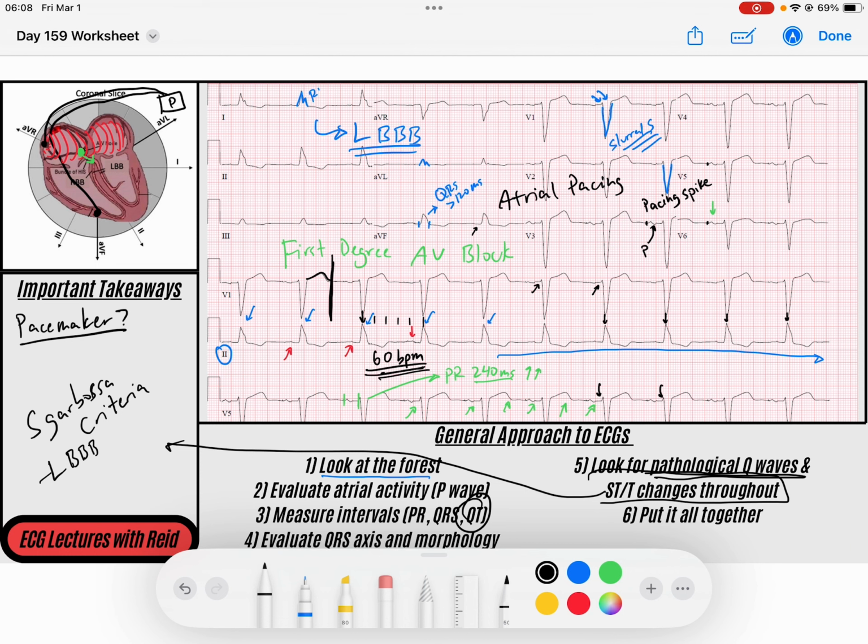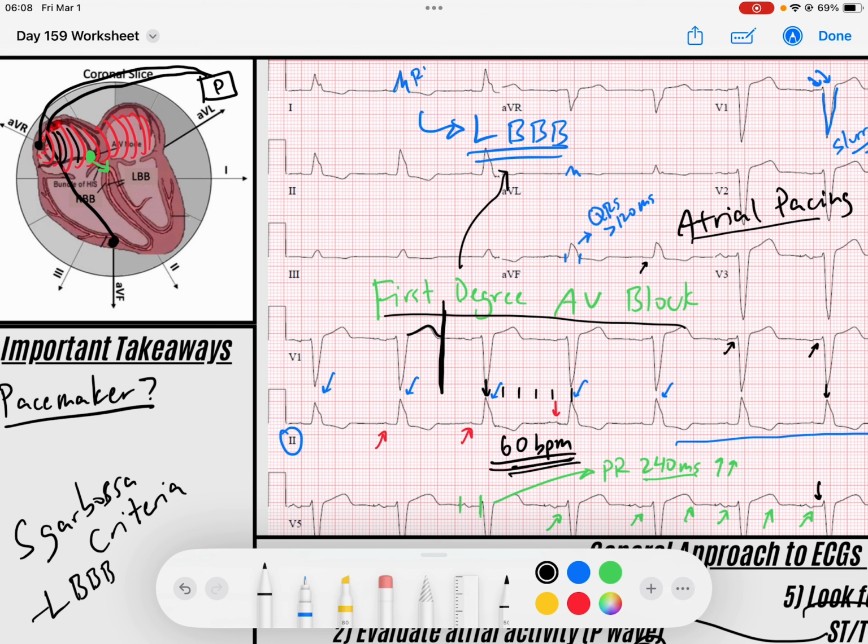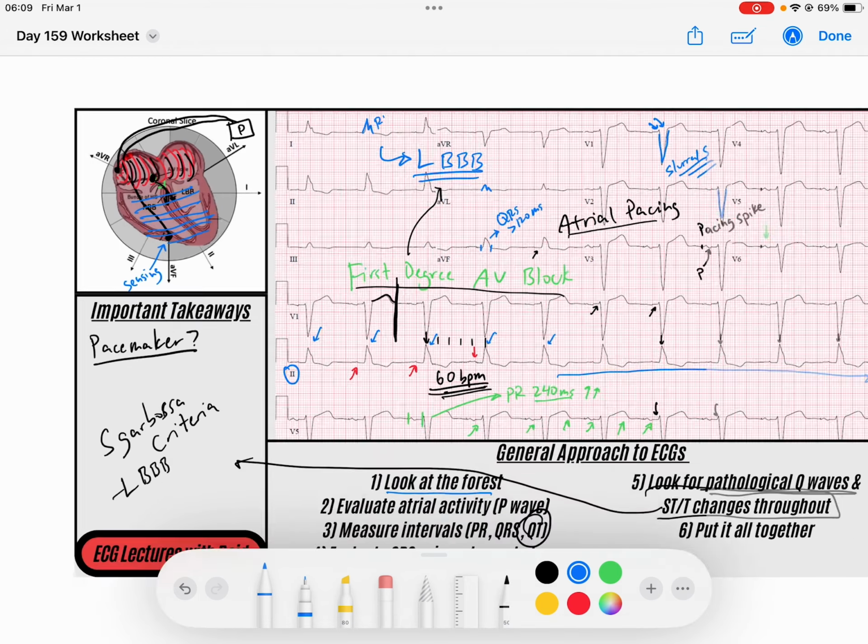And so what do we have? We've got a rhythm that has atrial pacing with a first degree AV block and a left bundle branch block. And so we know that nowadays the standard of care is a dual chamber pacemaker. And so in this case, what's happening? We have the pacemaker, like we said, beating in for the atria, and it's depolarizing the atria. What happens is the AV node captures that signal and it sends it down. And whenever it sends it down, we get depolarization through the ventricles. And that ventricular lead in the pacemaker is sensing, and it's waiting for that beat. And once that beat makes its way down, that pacing lead inhibits itself. It doesn't beat because it knows it doesn't need to beat, right?